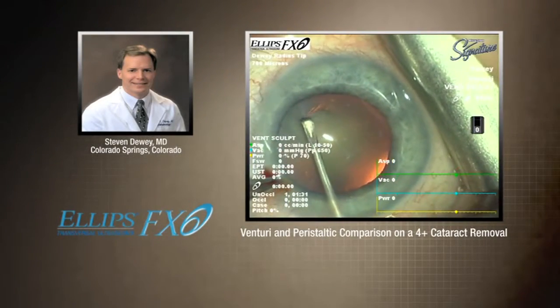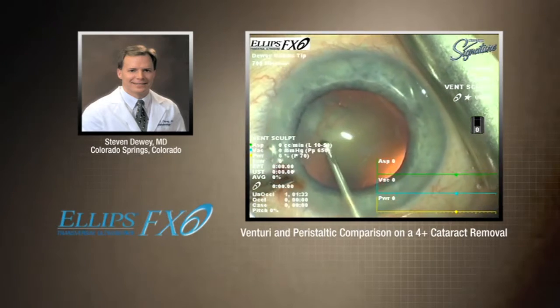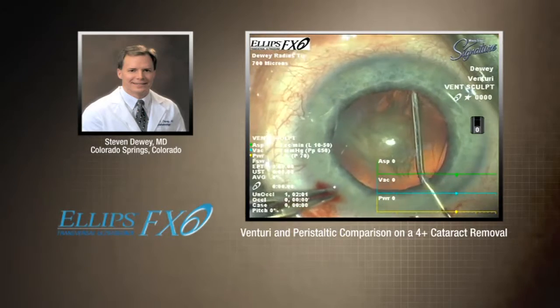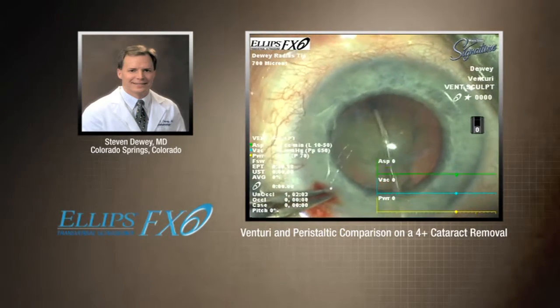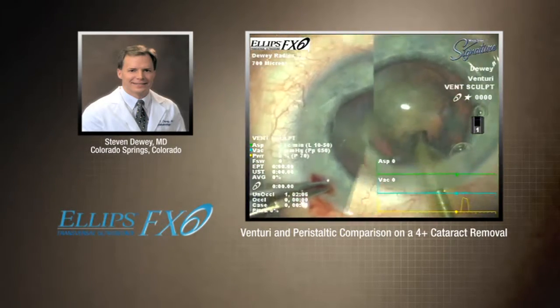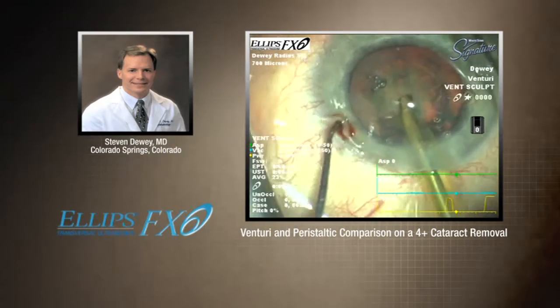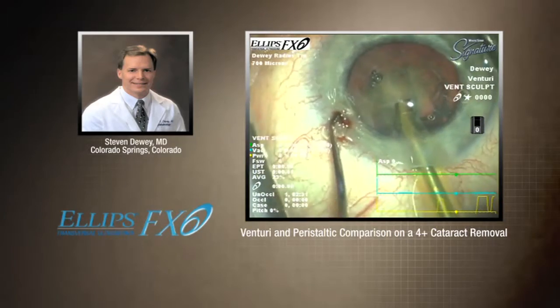Hi, Steve Dewey. Now this was a really nice lady — she's about 70 years old. She hung onto this cataract a lot longer than most people should, but she had a little macular degeneration and some health issues. So really, we're right here at that 4-plus level. This is a pretty healthy cataract.